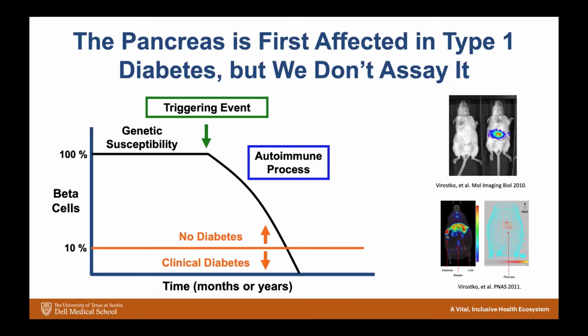The concept of nuclear imaging, like a PET image or a SPECT image, I'm sure you're familiar with, is taking a radioactive molecule and targeting it towards something. Typically, the common PET ligand that's used in the clinic right now is FDG, or fluorodeoxyglucose. That's a radioactive glucose marker, and it's really useful because we can track where glucose goes in the body. So for instance, FDG goes to tumors because they're very glucose avid, and we can detect that glycolytic activity occurring in tumors much more strongly than the surrounding tissue.